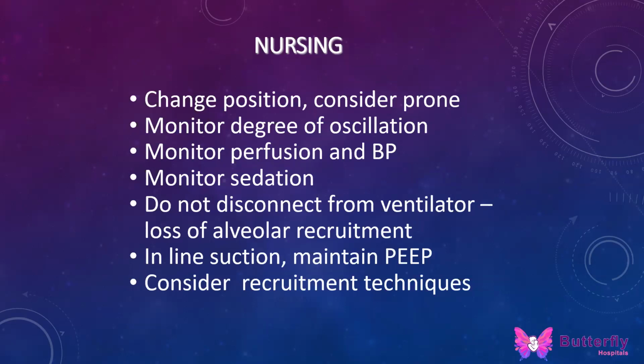Again, the prone position does help some babies, but it's not really practiced because most of these babies who are on high frequency also have umbilical lines and central lines. So it's not much routine in practice. Monitor degree of oscillation. Yeah, so it's just the amount of wiggle.